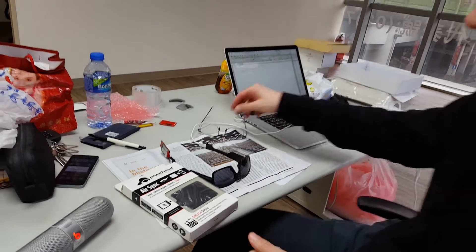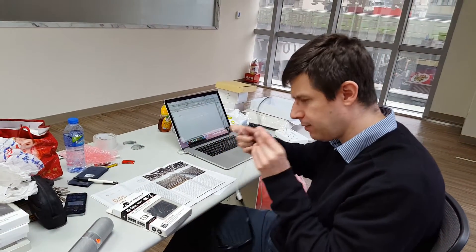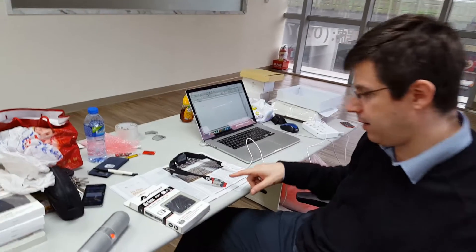Basically what we are doing here — I will wear my glasses again — we are actually sending that picture to a cloud server which will perform some OCR. It will basically check the characters and read back the characters to the guy who is wearing the PivotHead.